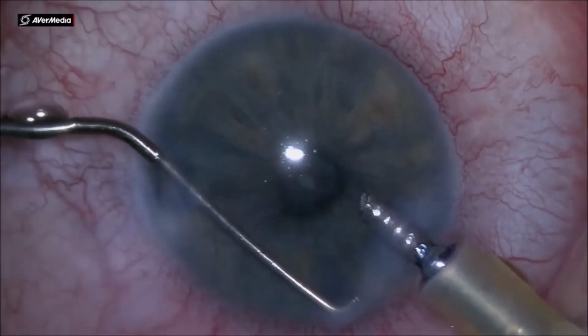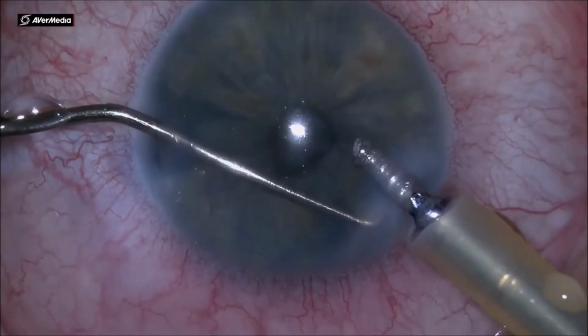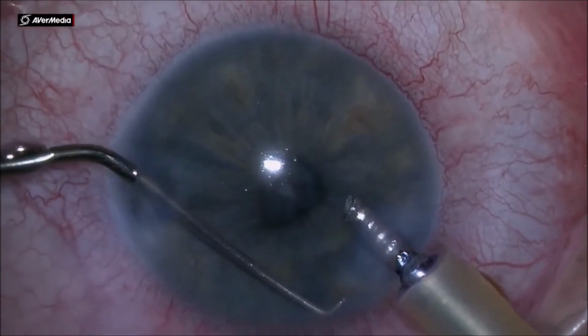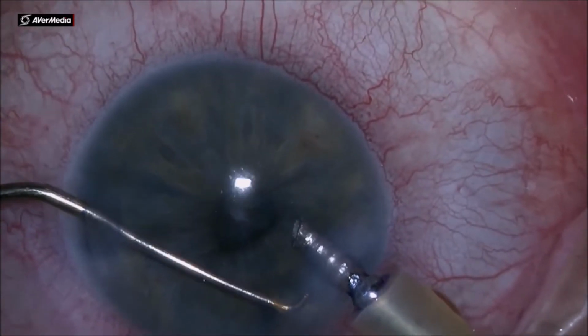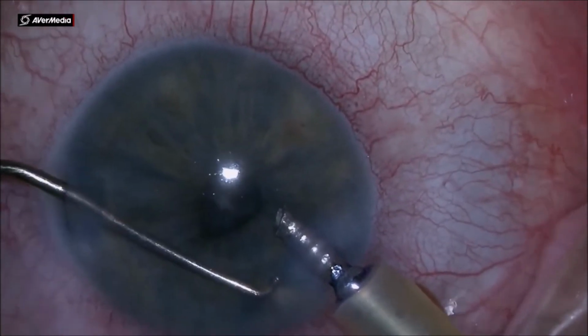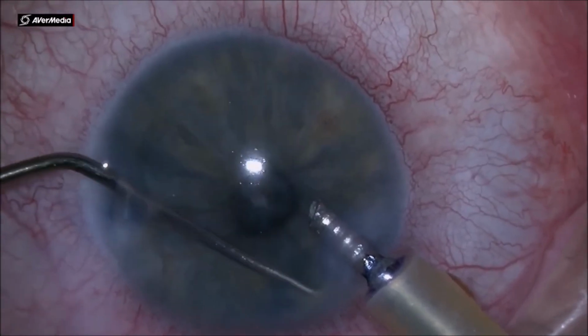But also in open angle glaucoma you have the phaco probe irrigating the anterior chamber, which will disengage the pigment from the trabecular meshwork.